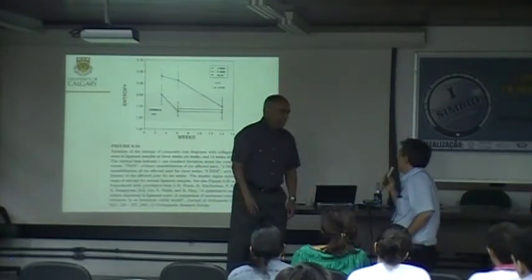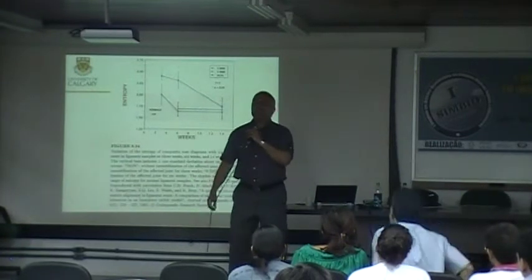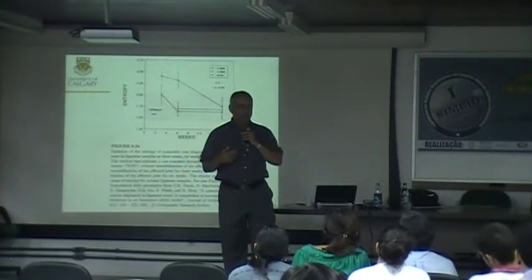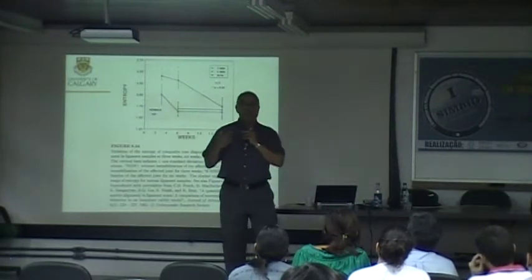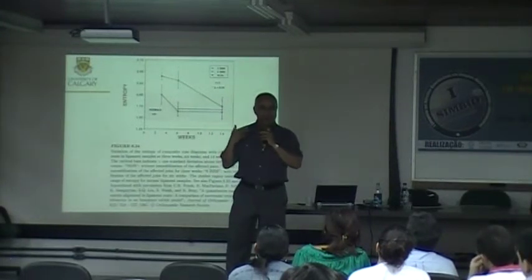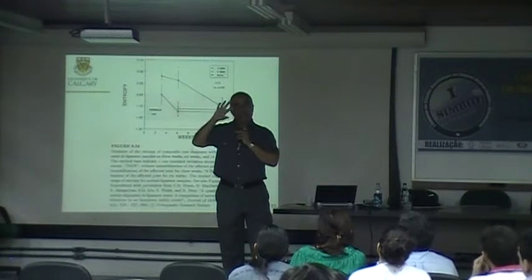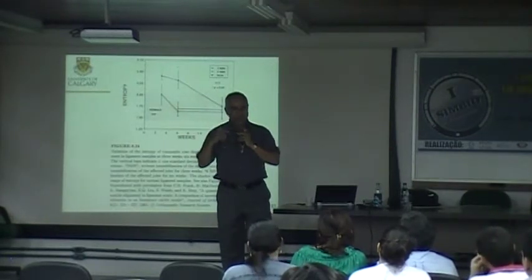What's your research today in this area? Mainly on retinal fundus image processing for an application in pediatric ophthalmology. For premature babies, there is a risk of development of a type of retinopathy called retinopathy of prematurity. If it is not detected early and treated, the child could go blind. And for that, we need to analyze the pattern of blood vessels in the retina. That is what we are doing.